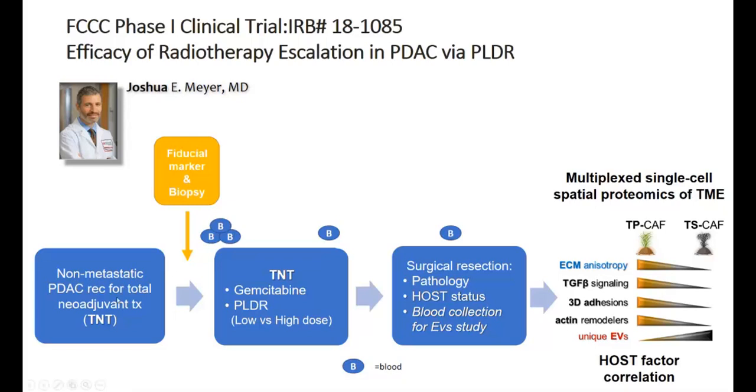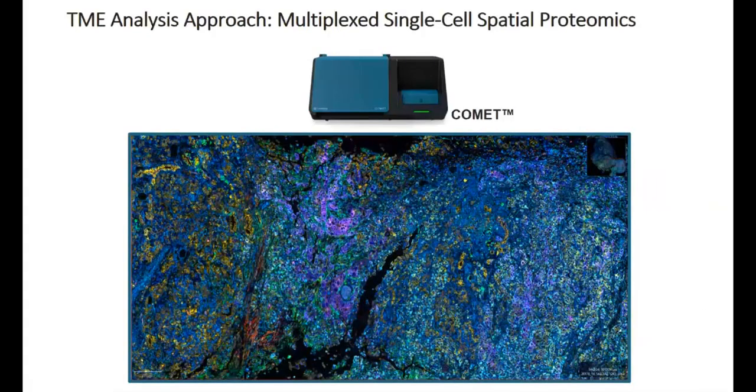And basically that is what I just described in vitro. We are trying to mimic something similar with the participation of patients and then assessing exactly the same parameters that I just showed you. And this is when we came with the new technology that is now available. Here I'm just talking about one of the instruments out there that could perform this type of technology. Then, through a multiplex single cell analysis, we can understand better the stroma of these cancers.